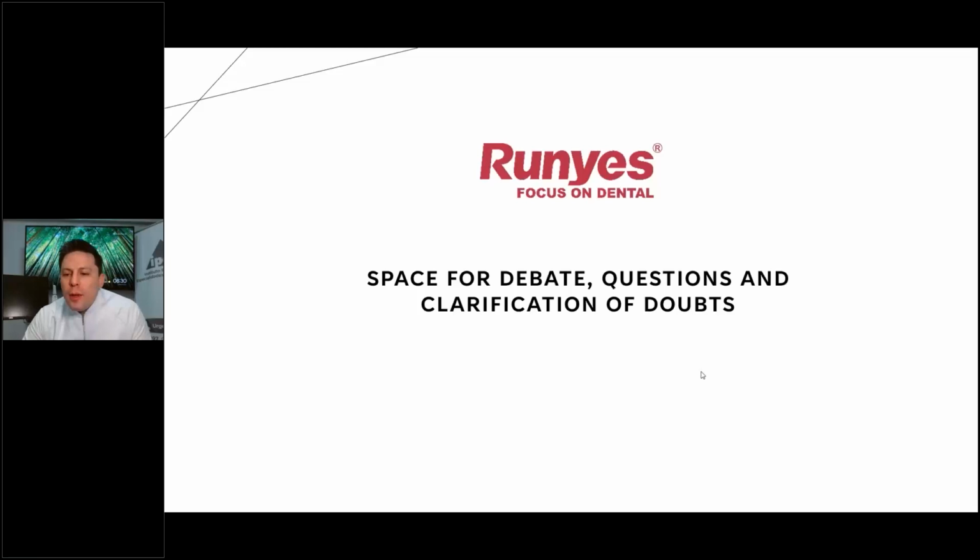Elnur, we don't need to calibrate our scanner. This scanner actually auto calibrates itself, so it doesn't need calibration.